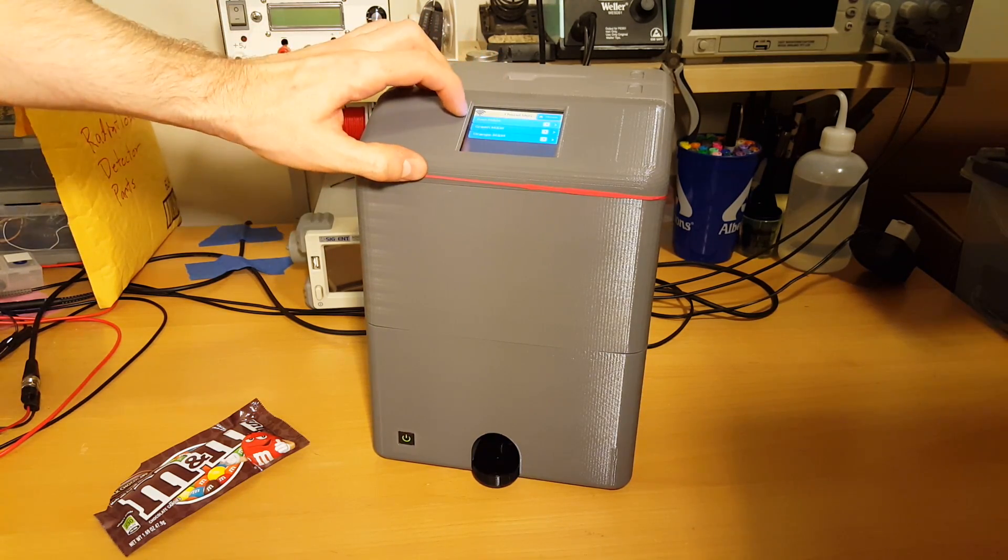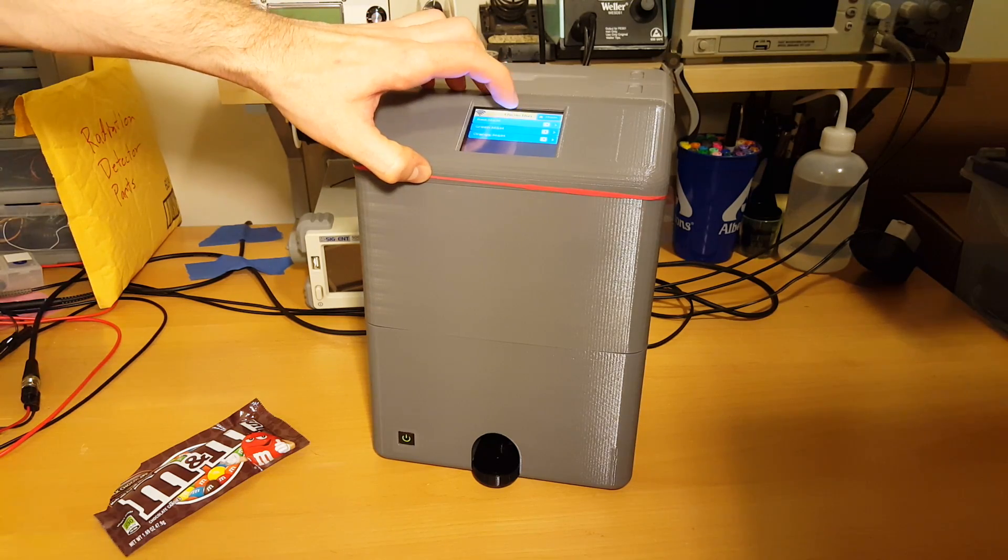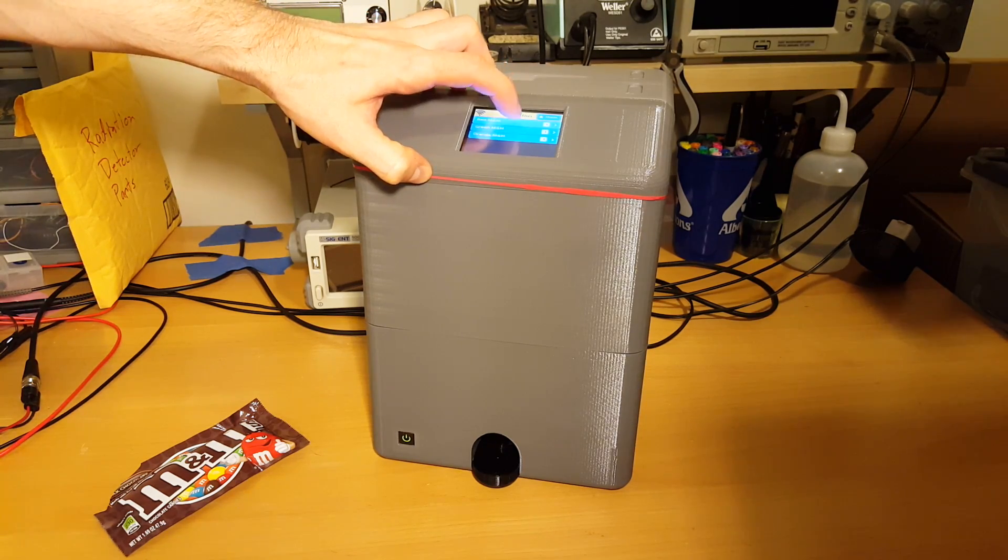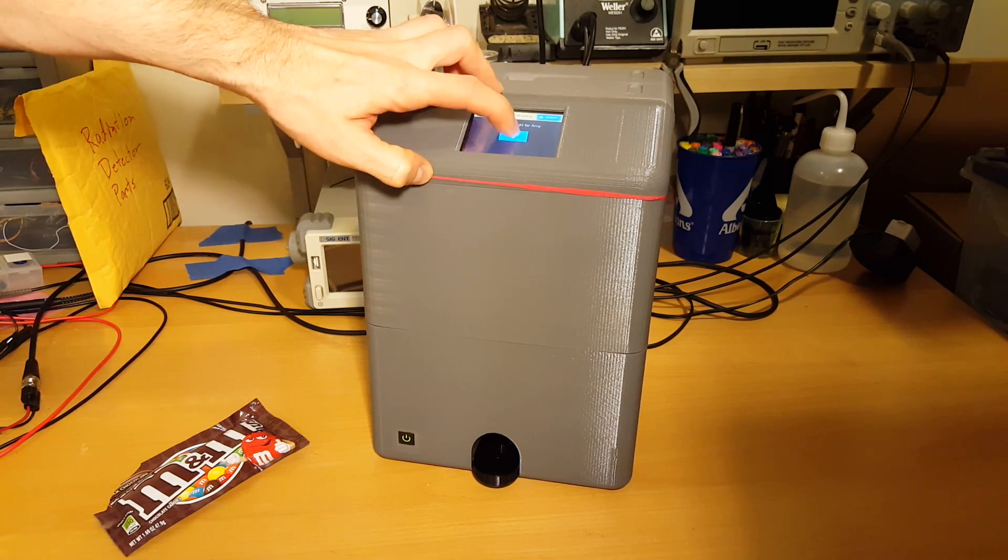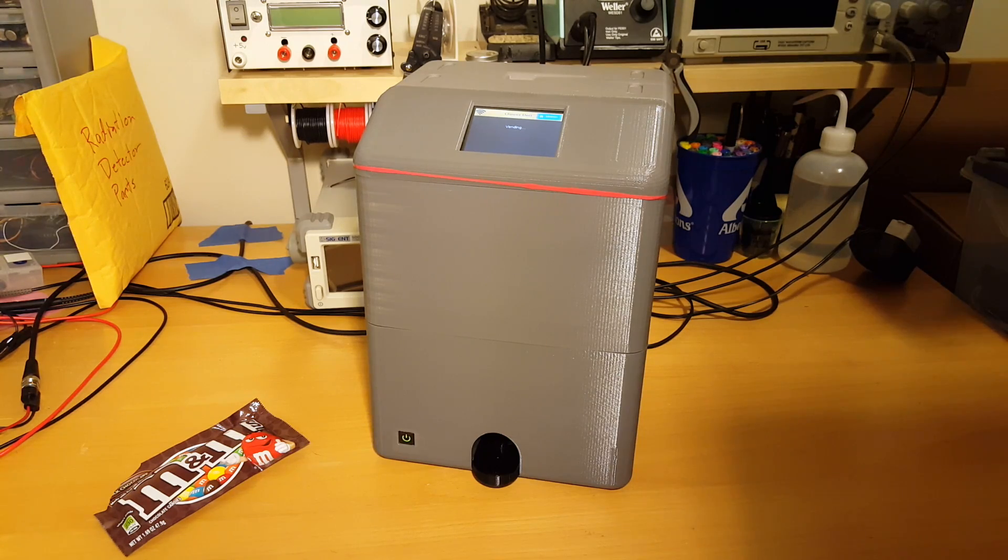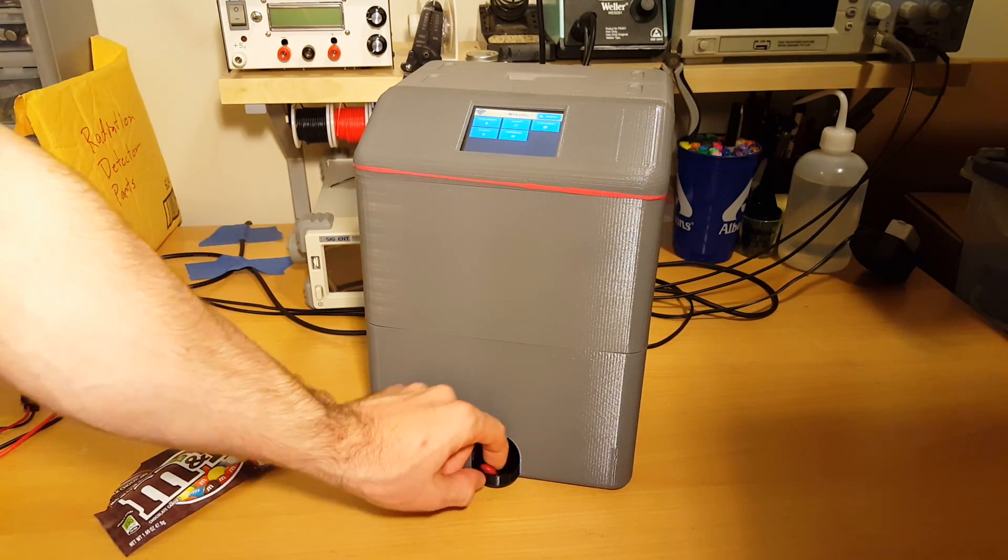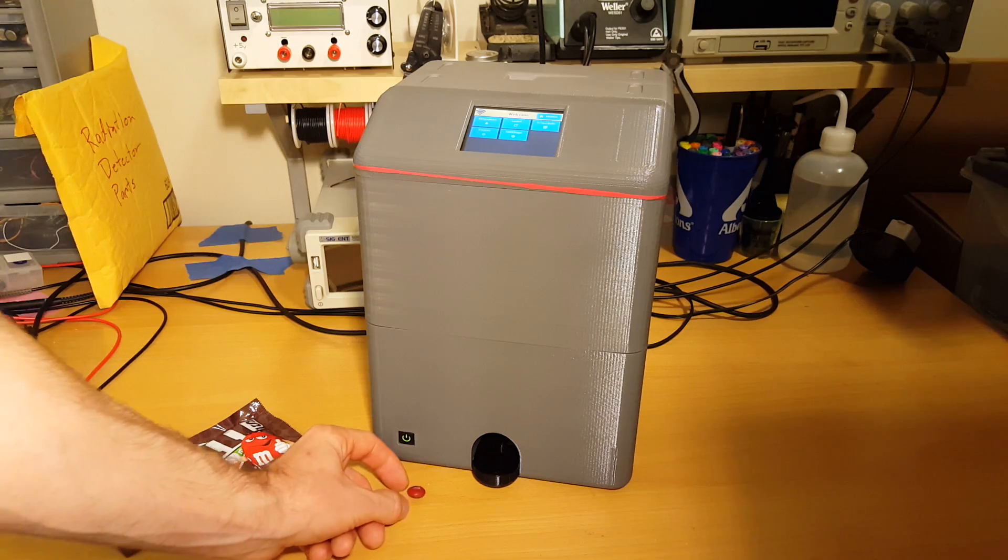And we'll dispense, let's do the red M&M, one of the ones we just put in. Okay and there's the red M&M that just dispensed for us.